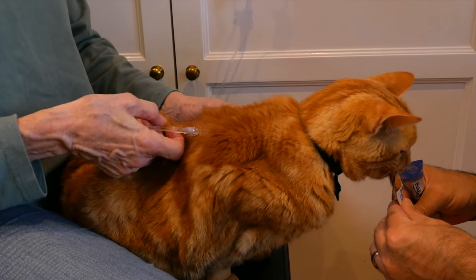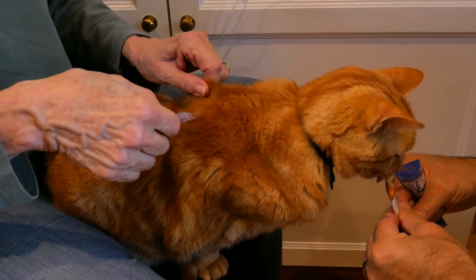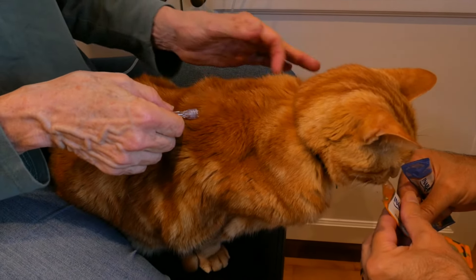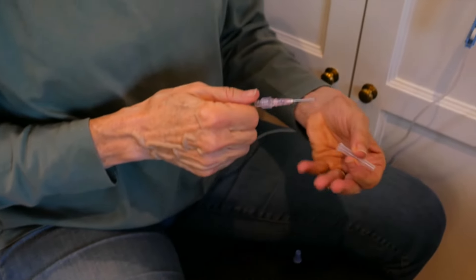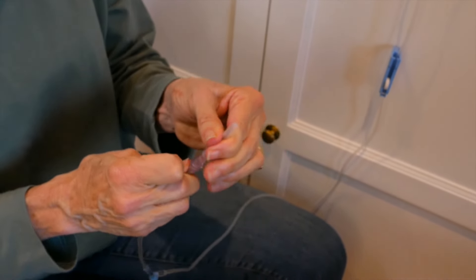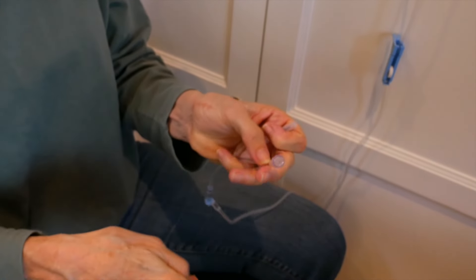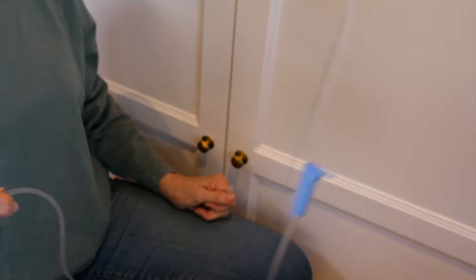As you can see, I'm not really even holding Nimitz. He's very comfortable for this. As the fluids get really full on this side, I'm going to gently pull the needle back and direct it over the other shoulder so that the fluids start to build up on the other side rather than all being on one side. When he's received 150 mils, I'm going to close the valve. Before I remove the needle, with the needle out of him, I'm going to replace the sheath carefully so I don't jab myself. I'm going to remove the line from the needle and carefully replace that blue cover onto the end of the line, and everything's ready to go for tomorrow. And that's how simple giving fluids is. I hope this helps you help your kitty feel better.